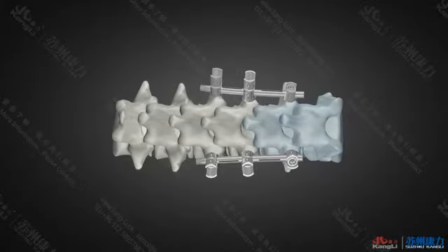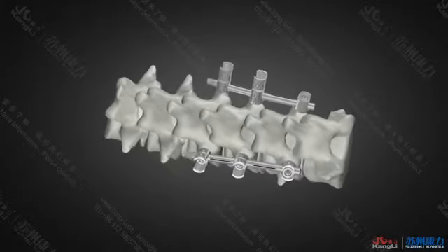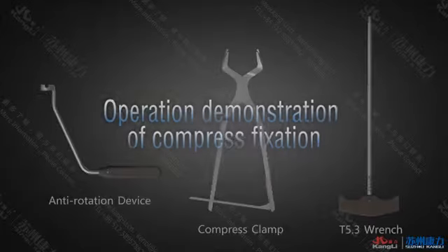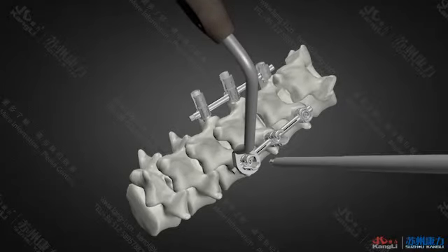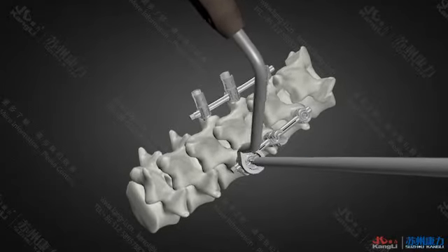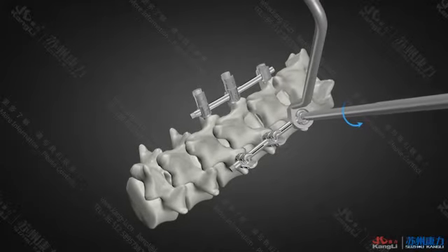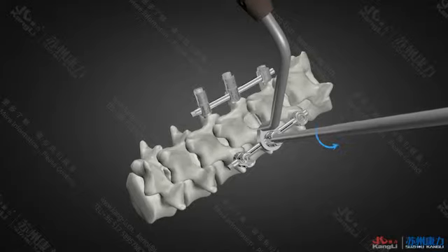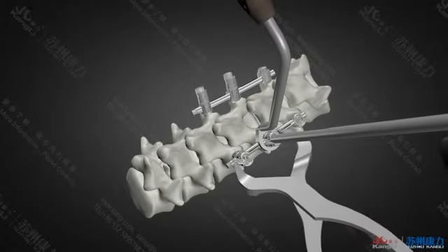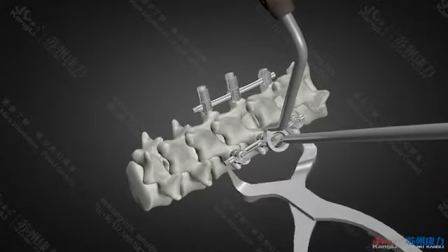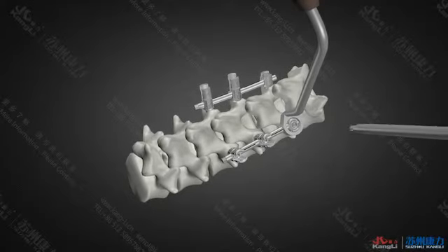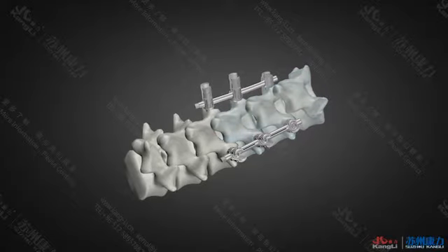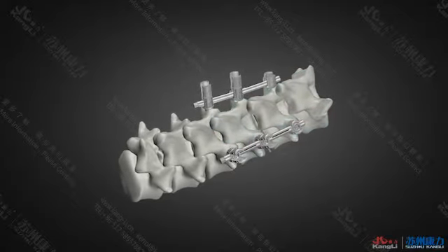Repeat the above to finish the operation on the other side. Operation demonstration of compress fixation. Use the T5.3 wrench and anti-rotation device to fix the plug screw on one side while the plug screw on the other side is loosened. Place the compress clamp and compress slowly to the proper state, then wrench the loosened plug screw and finish the compress fixation. Repeat the above to finish the operation on the other side.